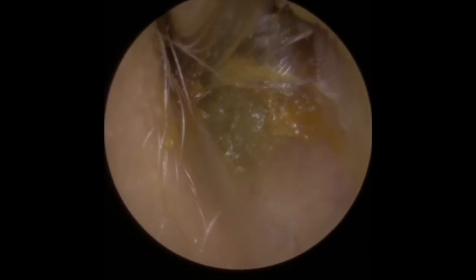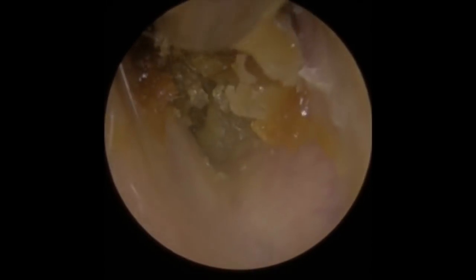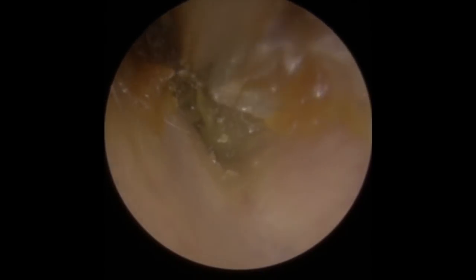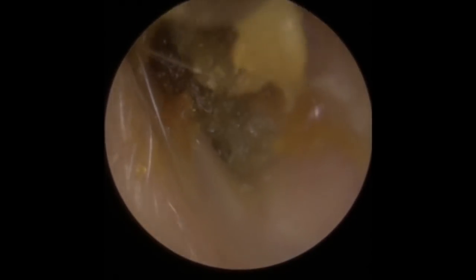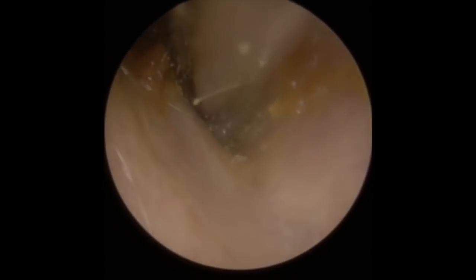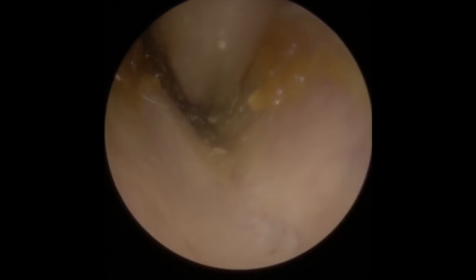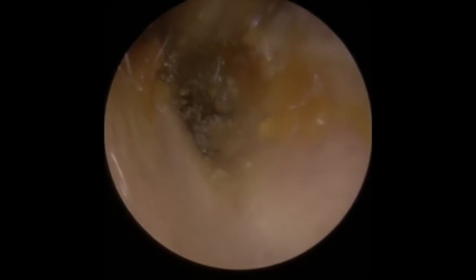You can see there are lots of bits of dry skin all around the outside edge of this wax. We're trying to strip that away because it's holding on to the wax and it also interferes with the suction. When the wax is this deep, we need to try and establish where the eardrum is as well. You'll see me suctioning at the bottom of the canal — what I'm doing is almost undercutting the wax slightly, so when I pull on the top section it will help to pull that wax down and peel it away from the canal walls more effectively.